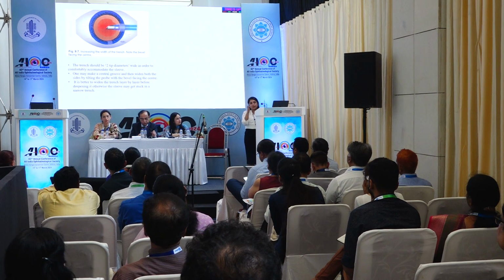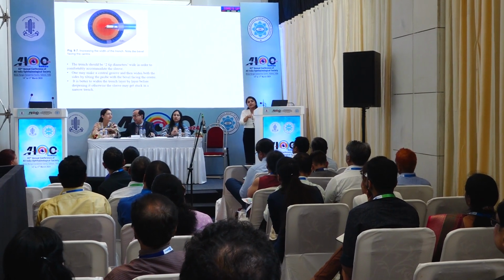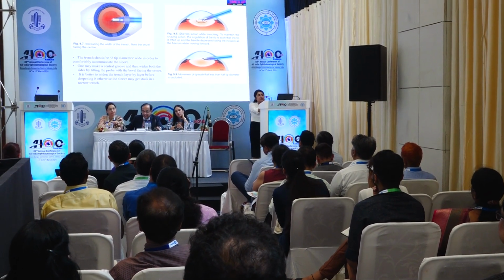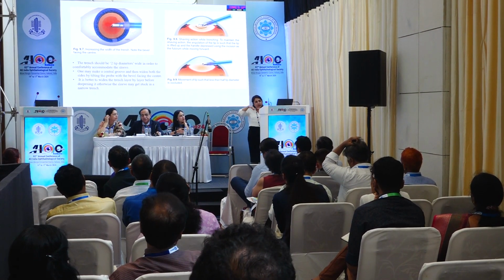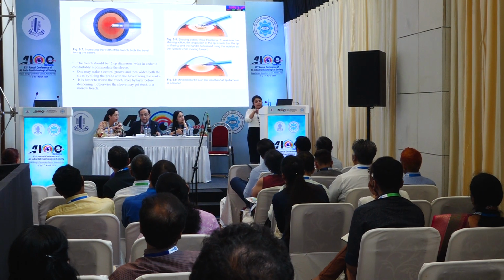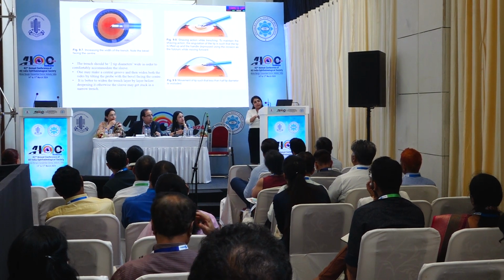On the two sides, it should ideally be 2 tip diameters so that the sleeve doesn't get stuck in the trench. And then shaving, so how do you do it? The best way is the tip should keep moving, should be up like this. It should keep moving like this, and the handle should be using the incision as a fulcrum. And once the superficial trench has been made and you've widened it, then you go to the deeper trench.